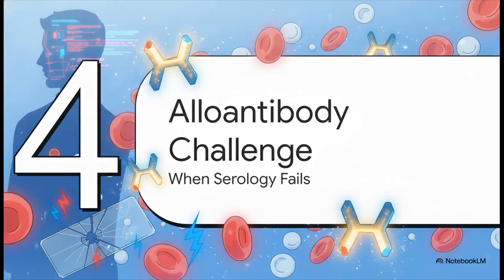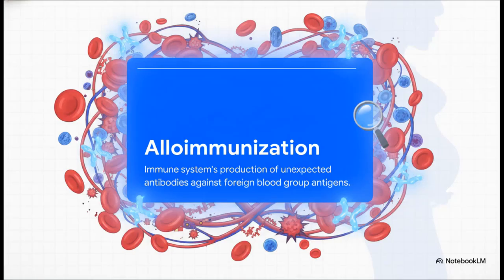Let's raise the stakes a bit and look at what happens when standard visual serology tests just aren't quite enough to guarantee patient safety. You see, the human blood system is vastly more complicated than just ABO and Rh positive or negative. There are actually over 40 recognized blood group systems.